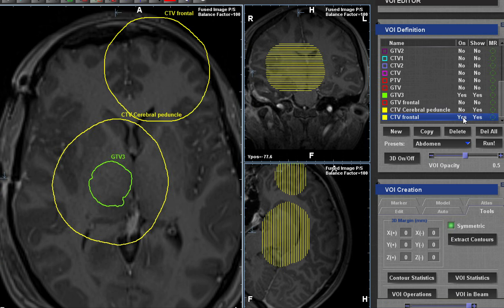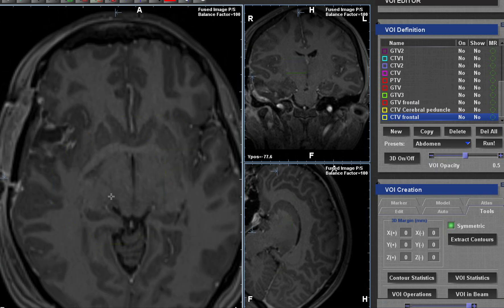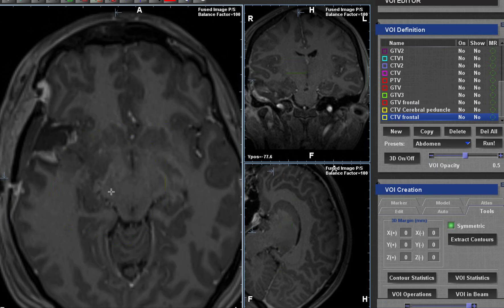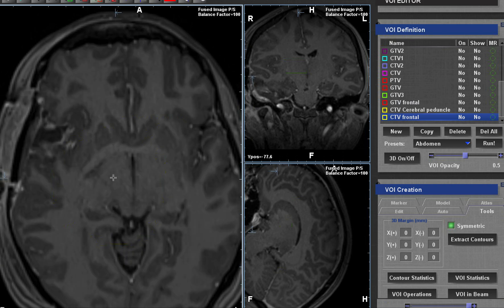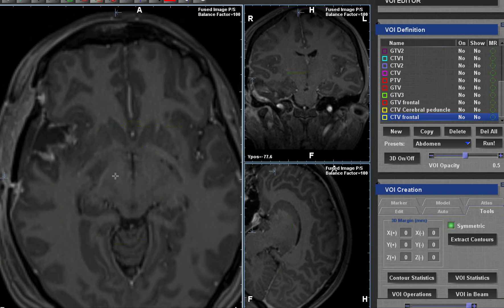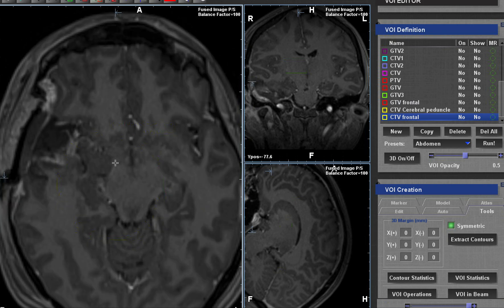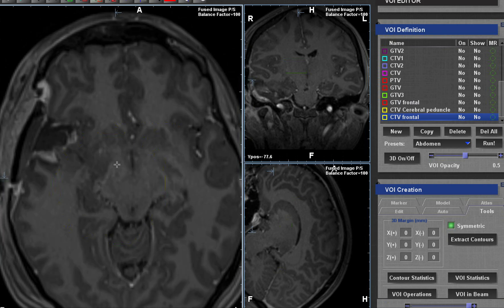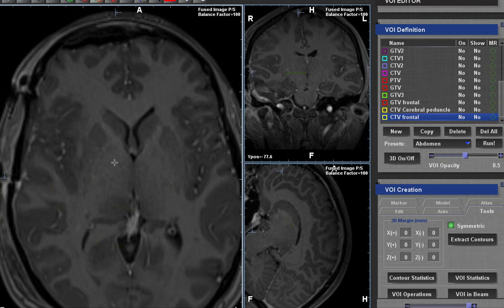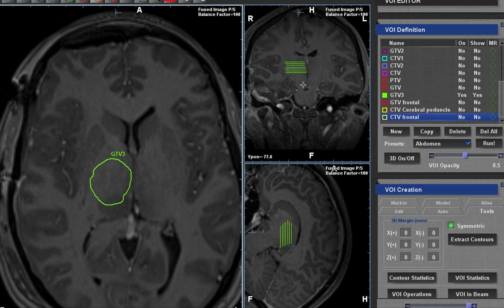In the coronal view, if you put your cursor down to the cerebral peduncle and push page up, you can clearly see white matter fibers connecting the cerebral peduncle. The cerebral peduncle is where the brain stem attaches to the hemisphere, so it connects to the thalamus. If you have a lesion in the thalamus in this area, it can easily extend down to the cerebral peduncle.